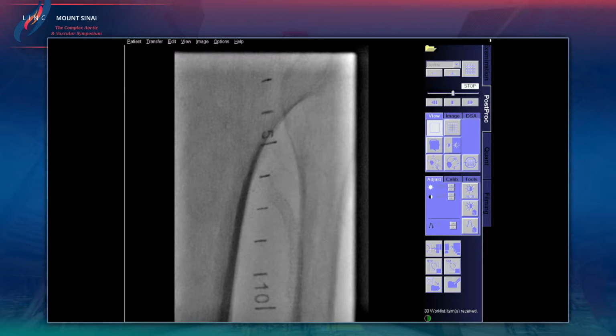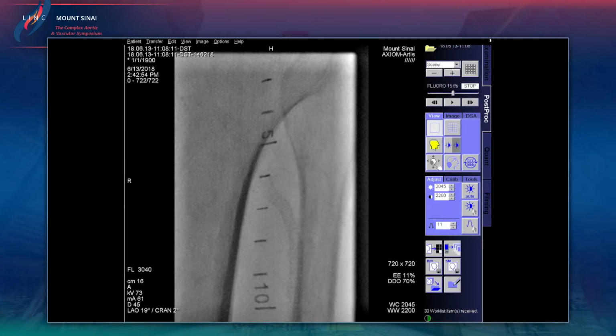Yeah, that's why I like to start with the coronary wires. I just find they're easier to maneuver. They are, but this wire has become part of our workhorse, and we've been able to do it most of the time. But for some reason, this arch is also very tortuous, and we've had a lot of trouble getting up and over because of his tortuosity. And a lot of times, the transmission of the torque, when you have such a tortuous arch, really makes it easier for an antegrade stick.